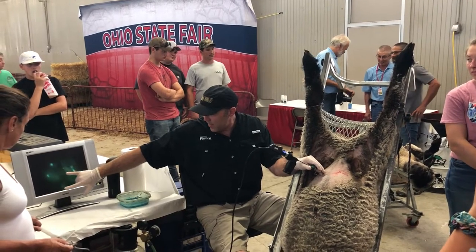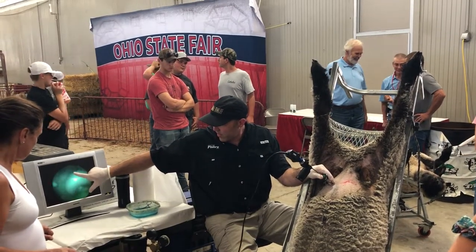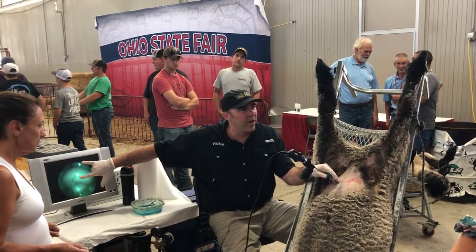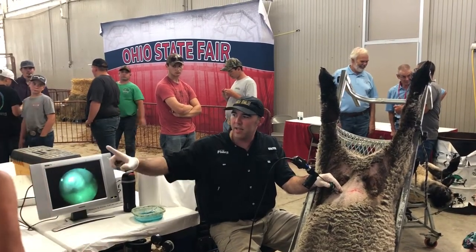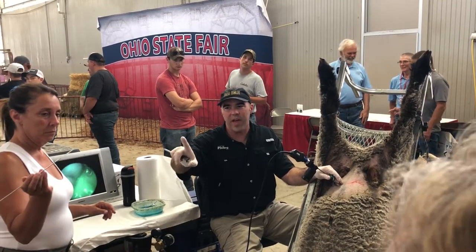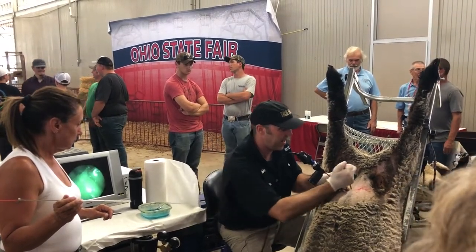So I'm going to stab the semen right about in there on each horn. Those are the uterine horns inside, and we want to place the semen. On the end of that needle, it's perfectly made so that it goes through just the wall of the uterus, but then it ends up inside the lumen. So that way we're going to put the semen in there.